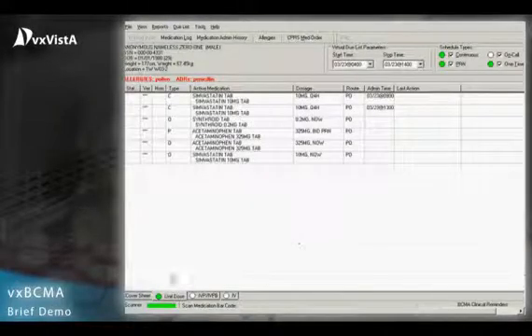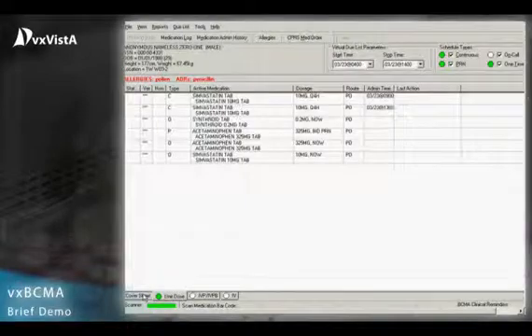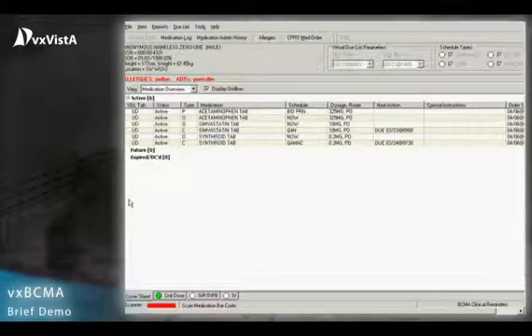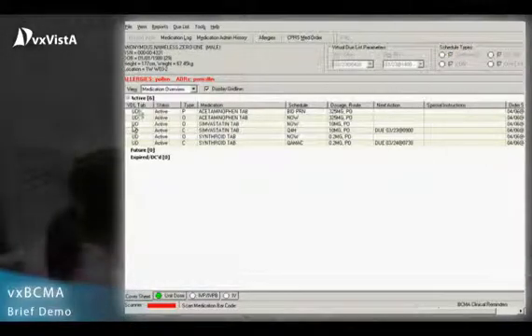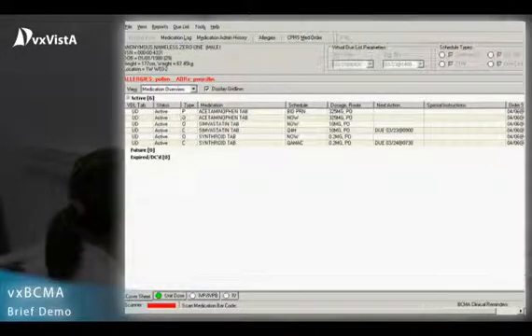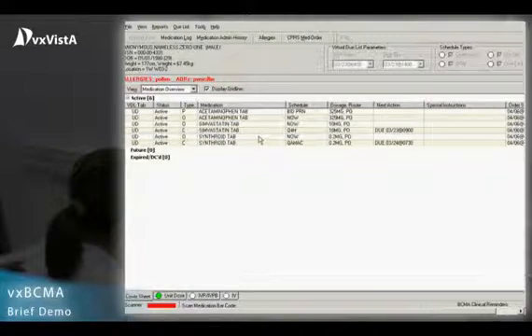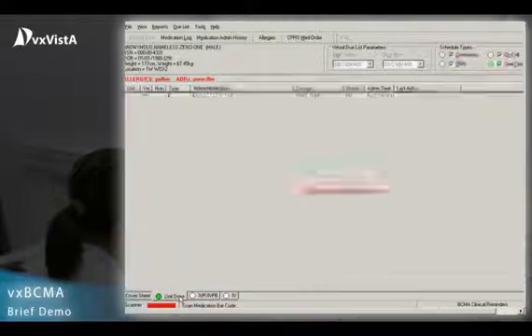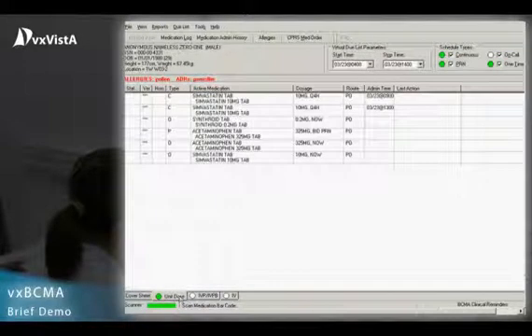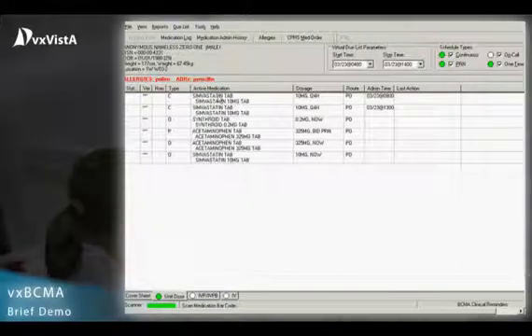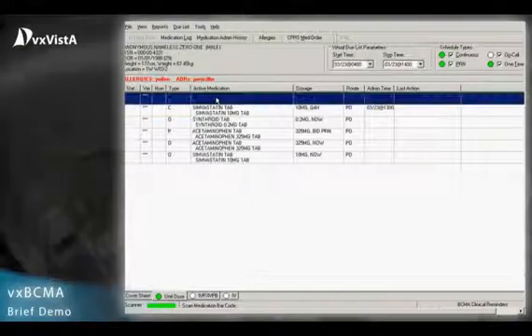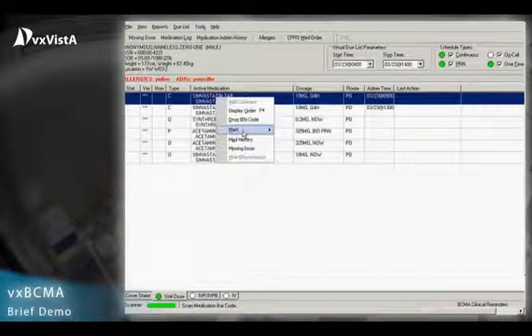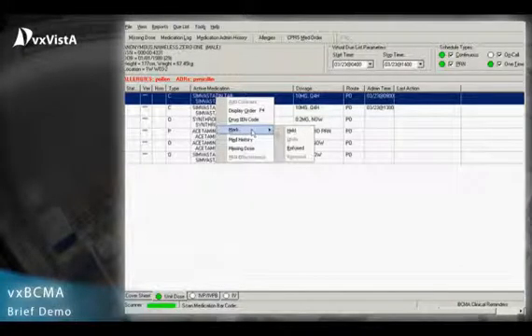This system greatly improves patient safety by requiring nursing staff who are administering drugs to scan both the patient wristband and a bar-coded medication label on the medication that has been processed by VXVISTA Pharmacy for the selected patient.